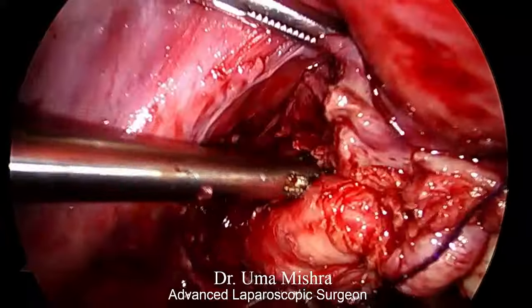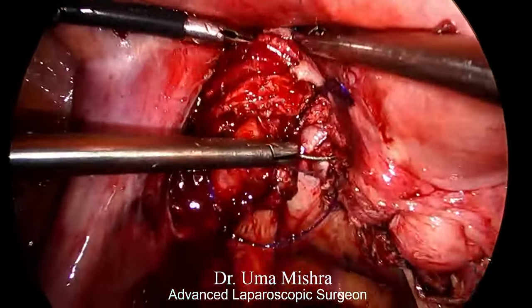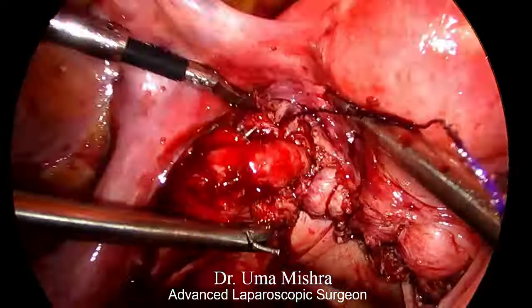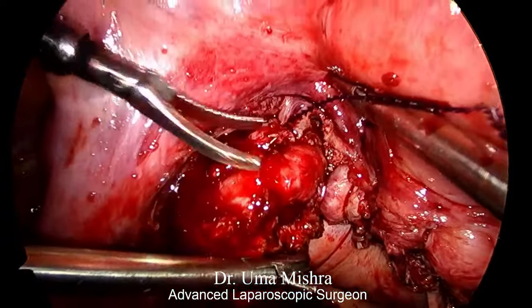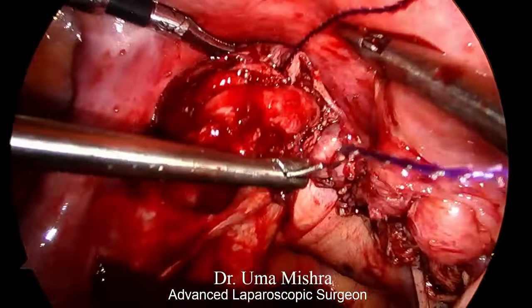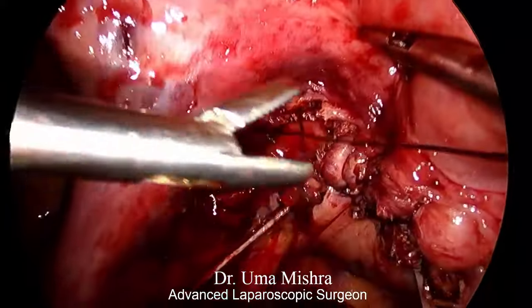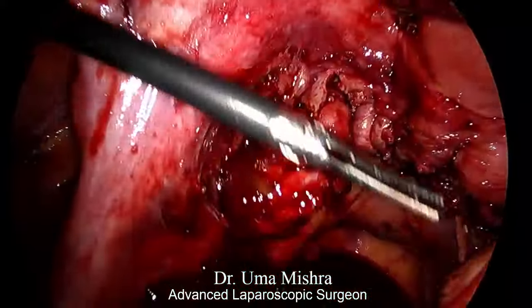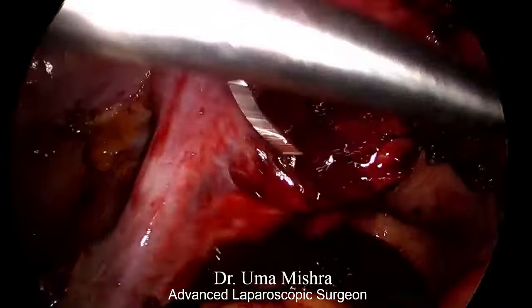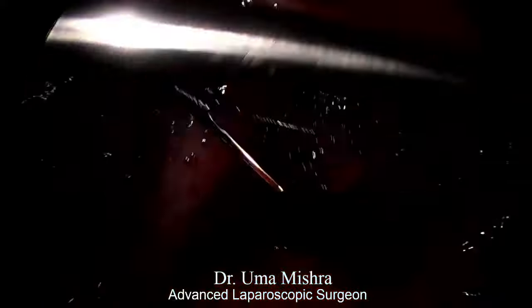While suturing, we have to keep one thing in the mind, that we have to obliterate the dead space nicely so the chances of hematoma formation can be avoided. And at this point, when we are working close to the angles, just keep ureter in the mind. As we have already dissected it, we don't have to worry.